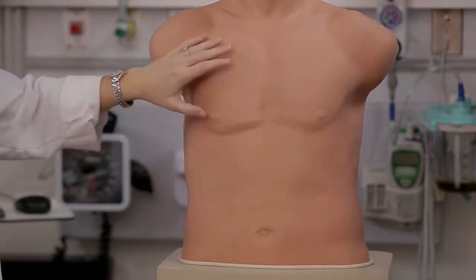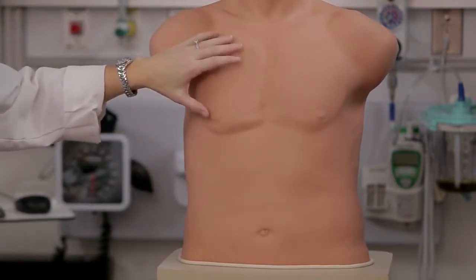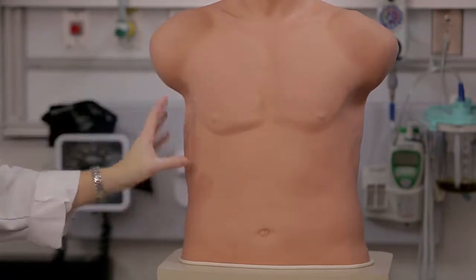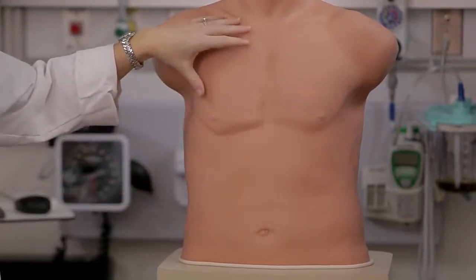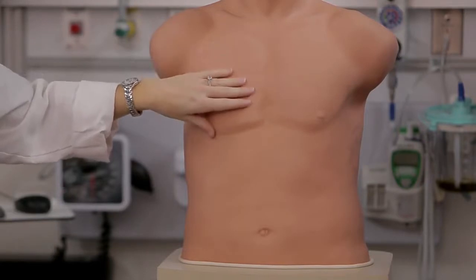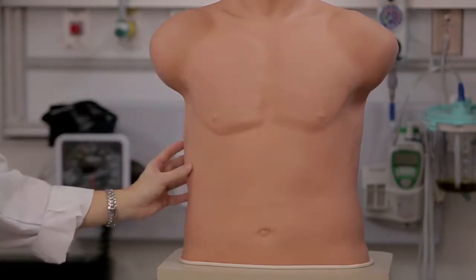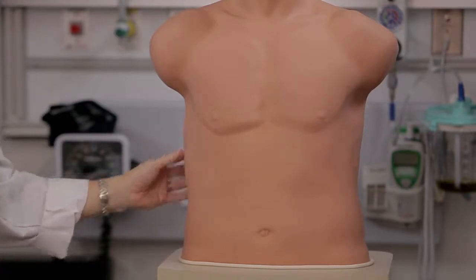On the right side, again, it's divided, as you said, into 3 sections. You have the upper lobe, the middle lobe, and the lower lobe. So if you were listening from the front, you would hear mostly upper lobe in this section, middle lobe in this section, and lower lobe more on the side and posteriorly. So now let's turn our mannequin around because we'll actually be able to listen to some of the different breath sounds, both normal and abnormal.